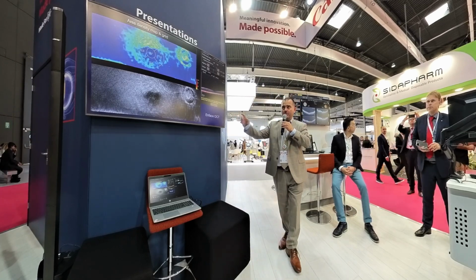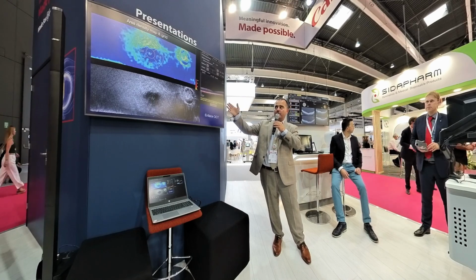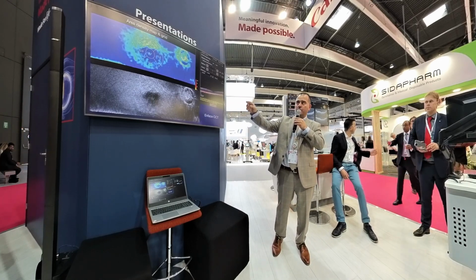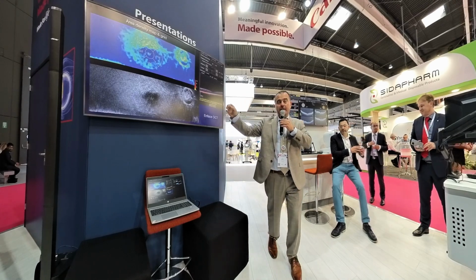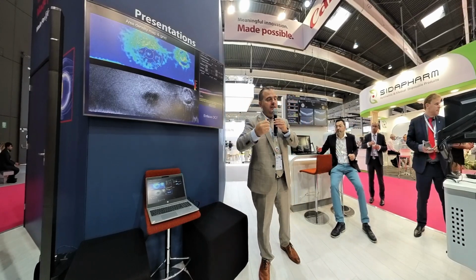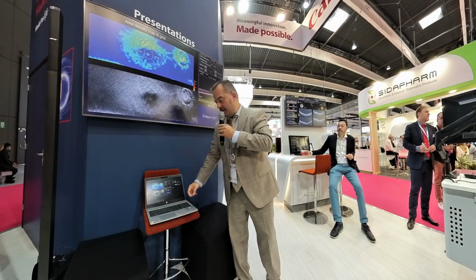This is another imaging modality on the same patient, and the coronal scan or en-face imaging shows the wrinkle where the ischemic event has occurred. So this is something which is not related to the surgeon or the surgery, and it is important to be able to explain why the patient doesn't see.